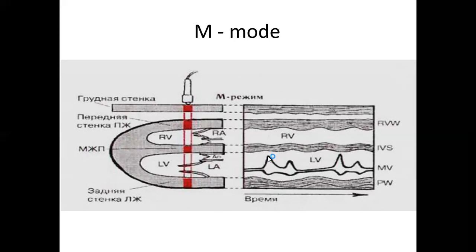Then you have these small peaks. They are located on one side. This happens during the first part of the diastole, when, because of the pressure gradient, blood is moving kind of passively, because of very high pressure in the atrium and low pressure in the ventricle.